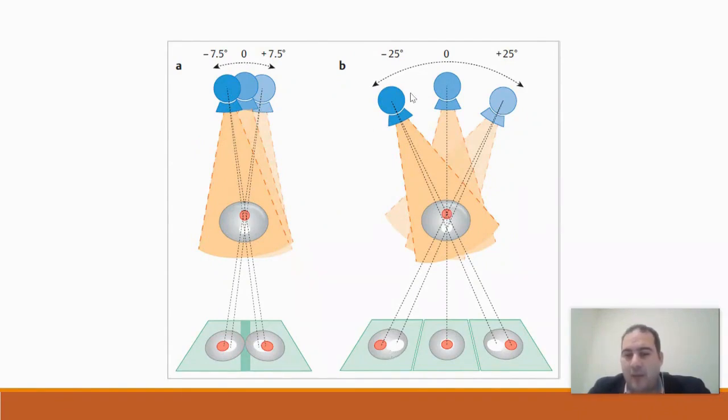On the other hand, at 25 degrees, you can see them in this way, allowing you to access more details from the tomosynthesis. This is the advantage of tomosynthesis. You can obtain images that provide more details for diagnosis and help you in the diagnosis process, enabling you to understand the nature of the tumor or lesion present in your image.